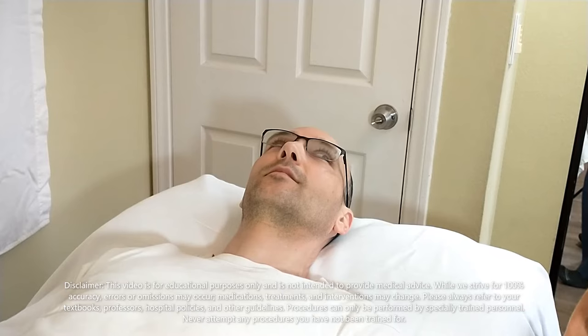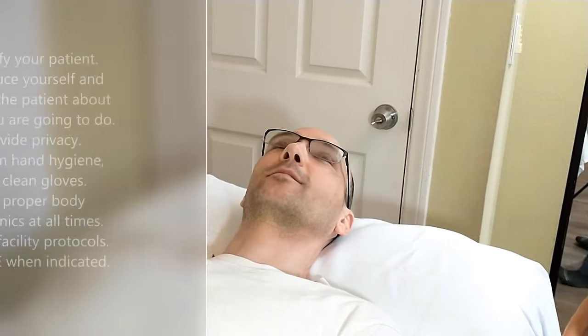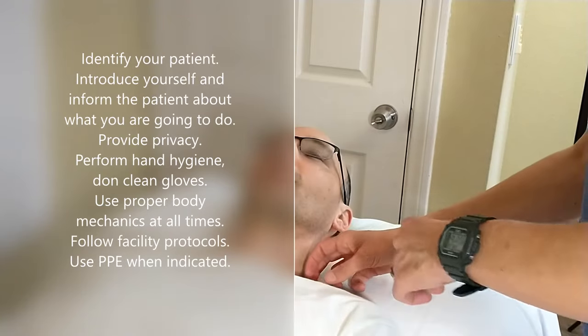Hi, I'm going to assess your apical pulse rate today, which means that I'll be listening to your heart for a full minute. Is that okay? Yes. Great. Let's move your gown down.